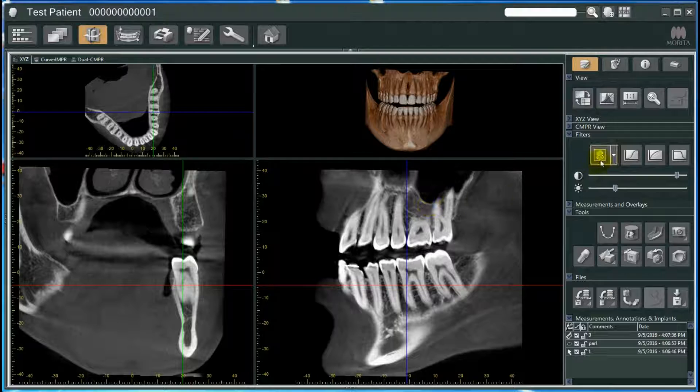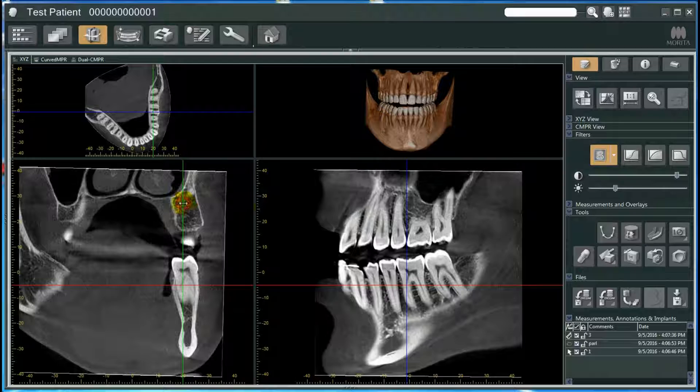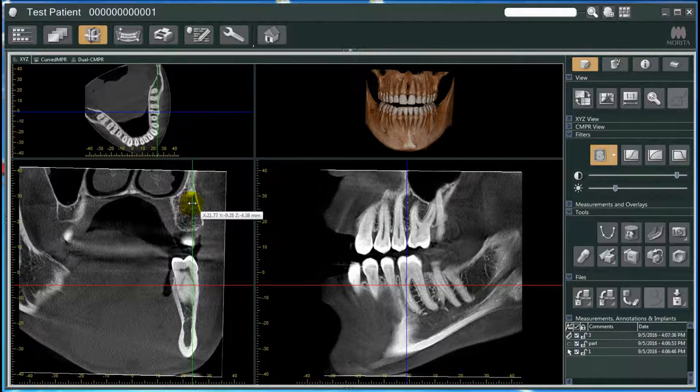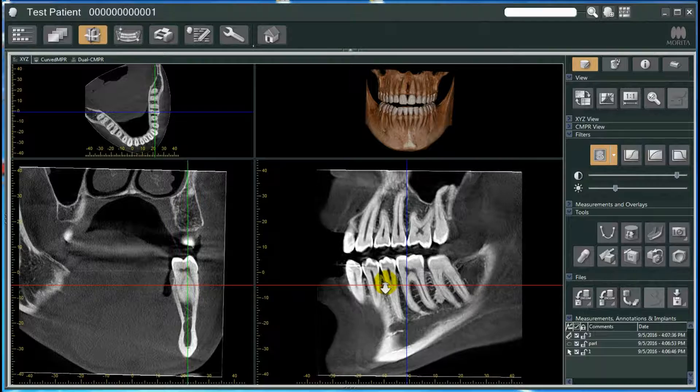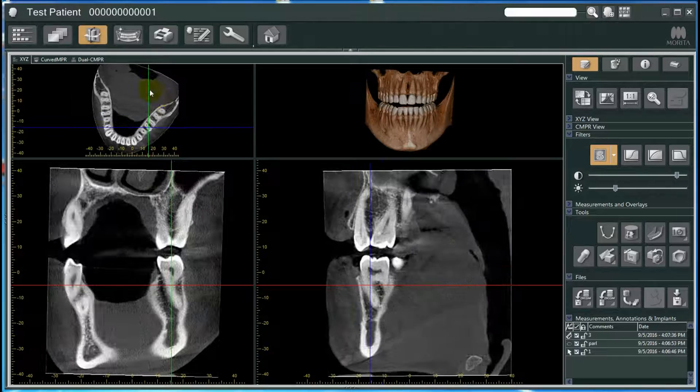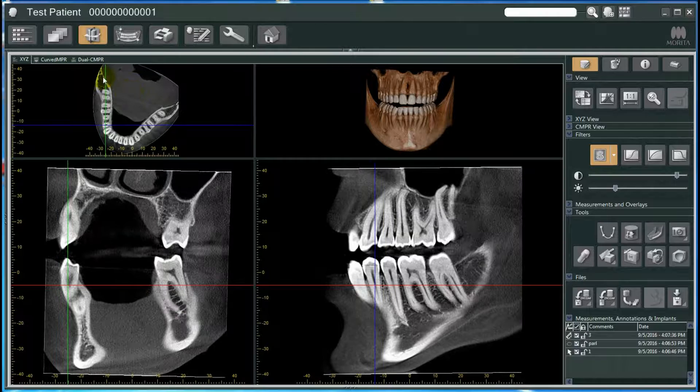Moving the image up, you can get a nice great view of all the teeth in one shot. I'll also sharpen the image just a bit — I like to sharpen it to get a little bit of clarity, see those PDL ligaments a little easier, see the canals a little easier. You can see in this instance how you can scroll through everything really easily and nicely. You get some great images here with the R100. And you can do the same thing on the other side by manipulating the image to the patient's right.